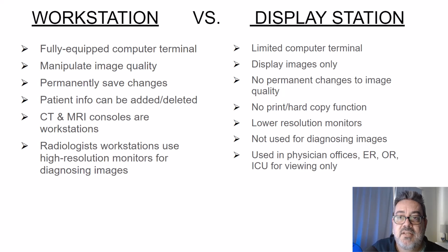We'll eventually discuss what you can and can't do at the technologist's monitor in the X-ray room. There are some changes that you can make prior to sending the images to PACS, where the radiologist will read the image, that can severely degrade the image and prevent them from seeing what they need to see.